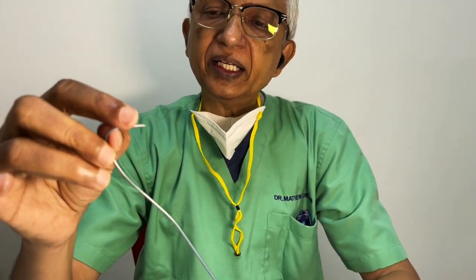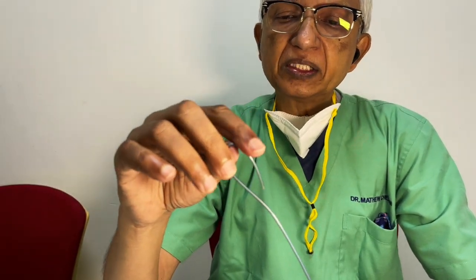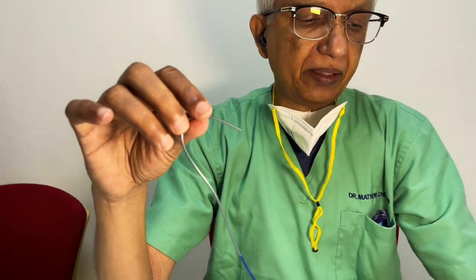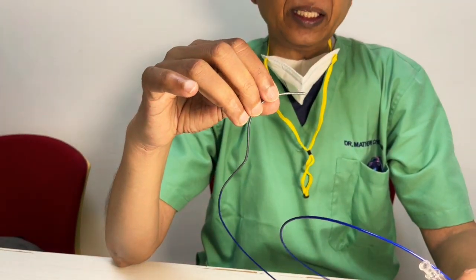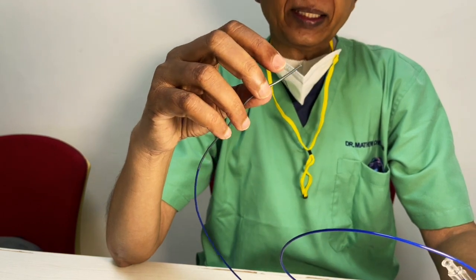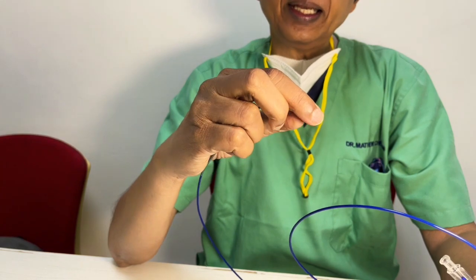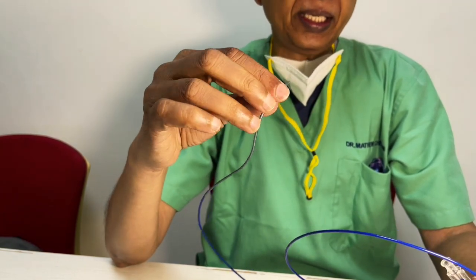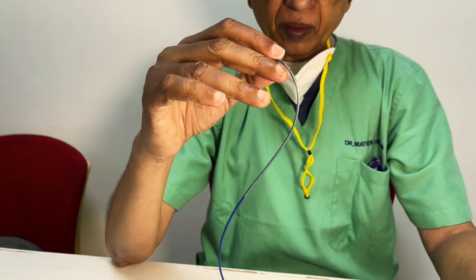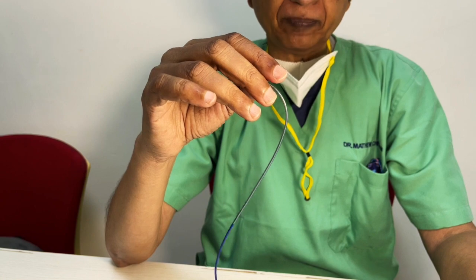Single braiding technically makes it more trackable because it can take the curve better. But somehow we have seen that React has combined both, a combination of two braids running, the X braid and the helical braid, both of them working together. And probably you may find that it does better in difficult anatomy, but the usage in India has still not been very high. But in our hands, we have found React an extremely good catheter, React 71.